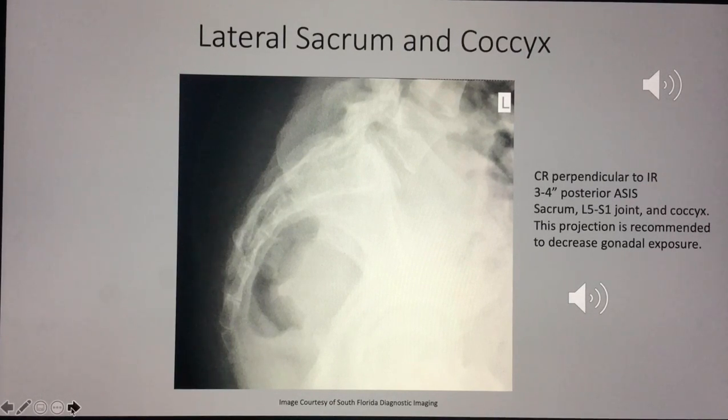Also you can see the femoral heads, both of them, one is higher than the other, but the greater sciatic notches should be superimposed, left and right. It's just a minimum rotation, but it's there.